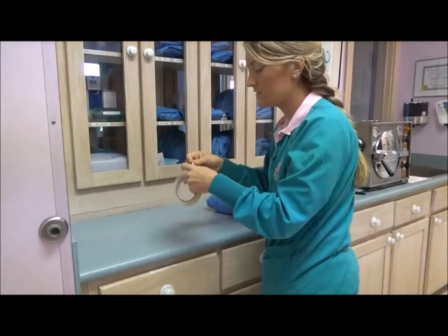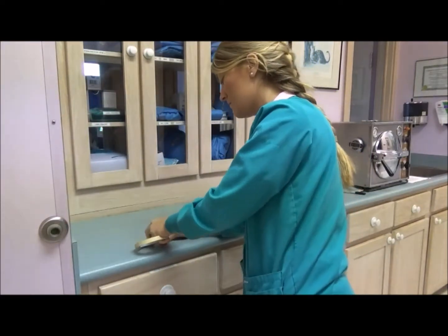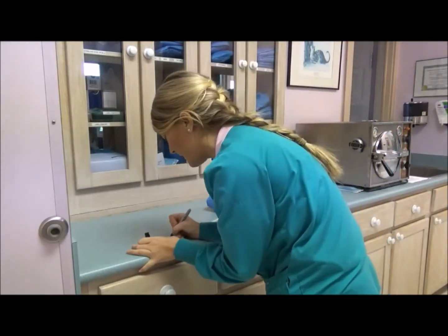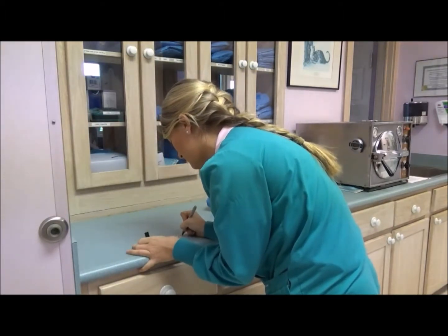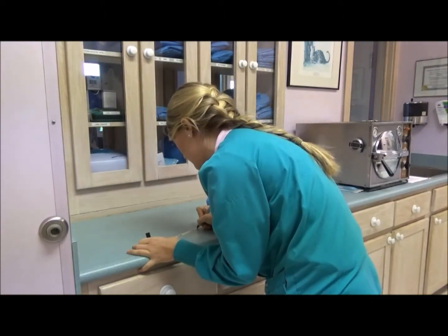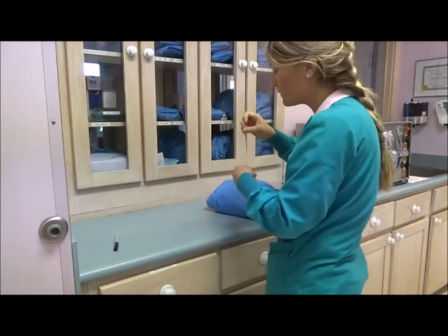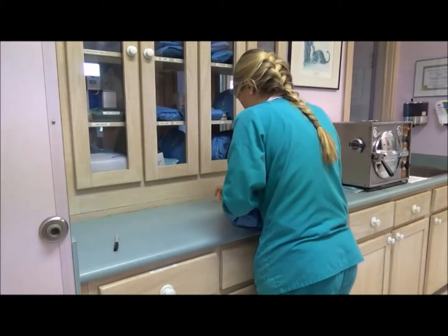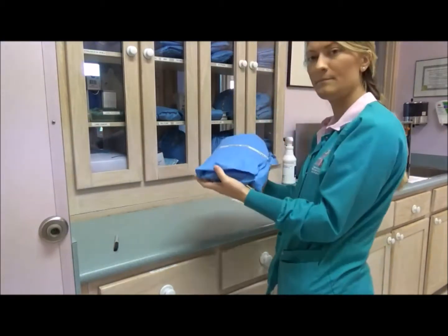And then last but not least, you want to seal the outer pack with some steam indicator tape. Just on the tape itself, you write what exactly you're packing, which this is our surgery pack. You put the date, today's the 23rd, and then your initials. That way if anything's wrong with the pack, we'll know who was responsible for packing it. And you place that right in the middle there. Okay, and that's all set.